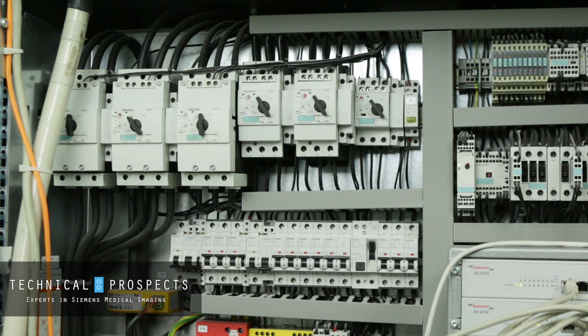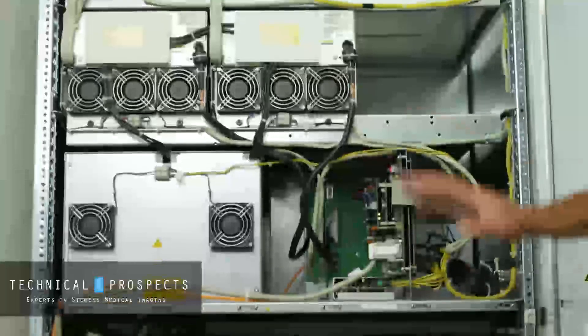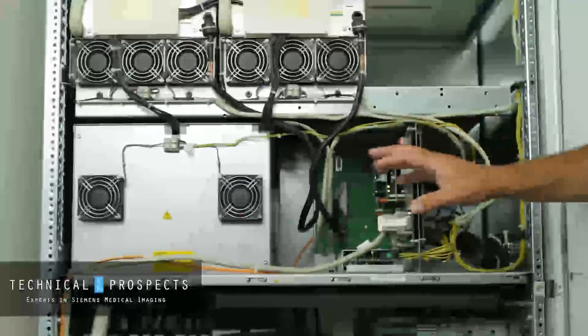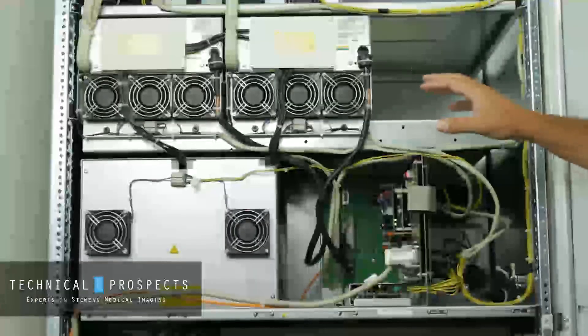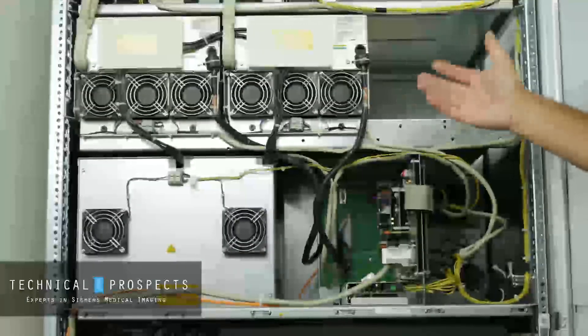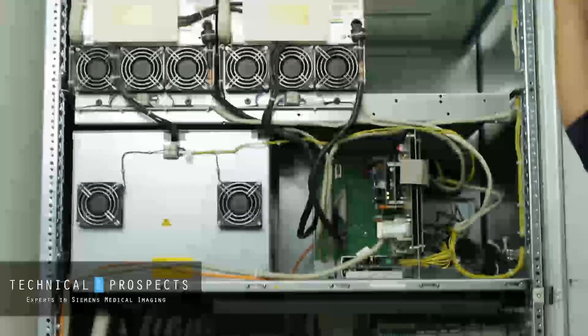One important thing to remember is that even though we just shut off those breaker assemblies for the gantry power, there's still some power on in the power distribution cabinet. In order to safely service the power distribution cabinet, you either need to shut off the main F1 breaker or the site power completely.